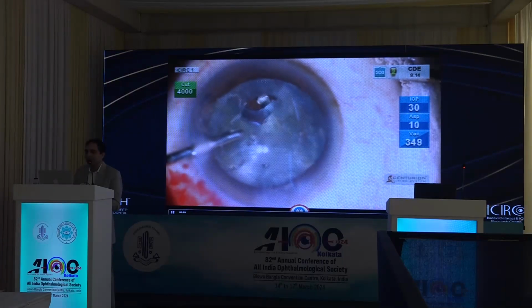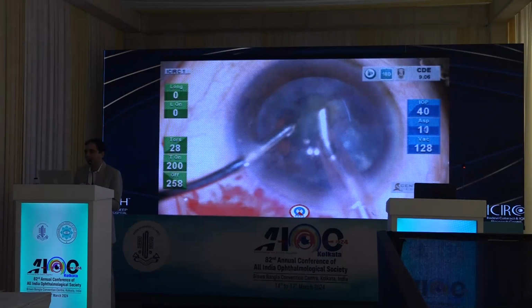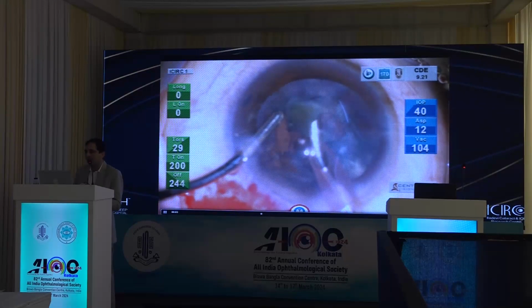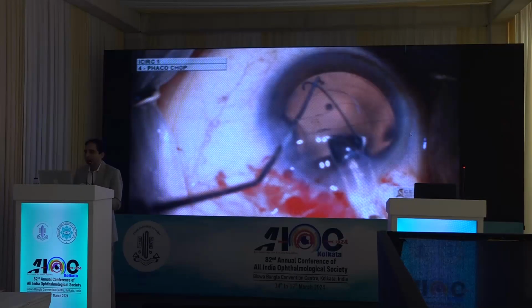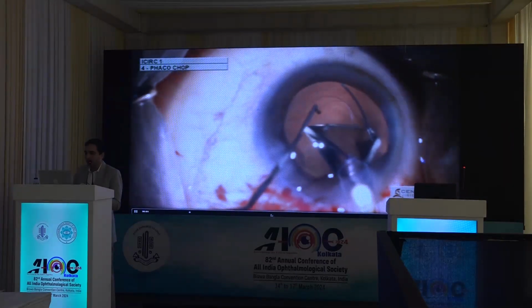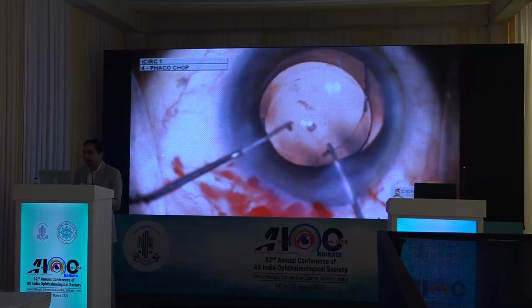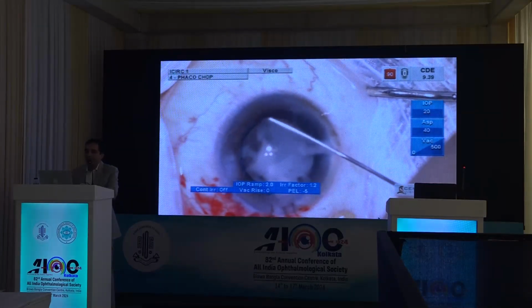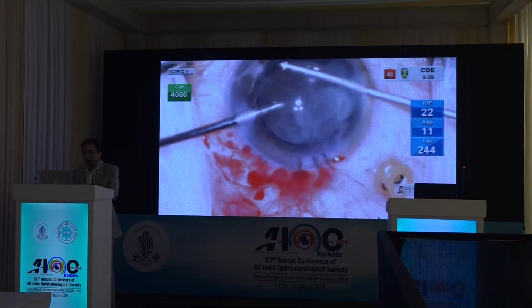And now since we have cut off the connection between the anterior and the posterior compartments, we can go ahead without the fear of dropping this nucleus, with phacoemulsification, with low parameters, low flow rate and low bottle height. Because this tear was extending up to the equator, the choice of IOL, of course, was a 3-piece IOL with optic capture. Most of these patients do very well post-operatively. And even in the end, make sure that there is no vitreous disturbance.